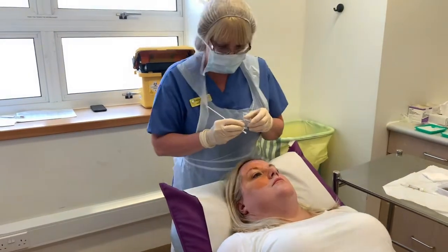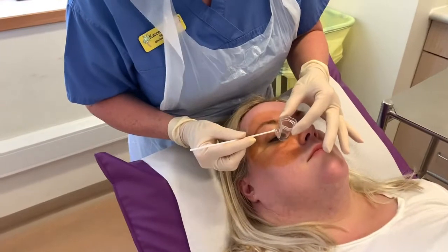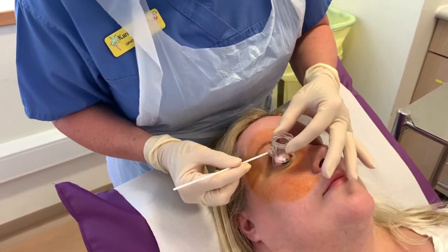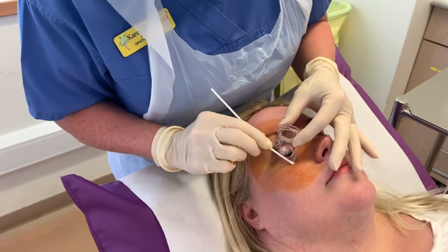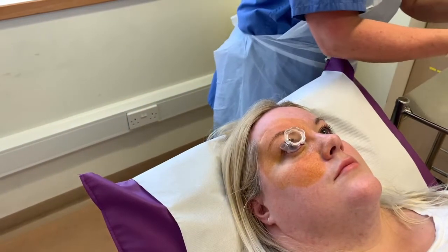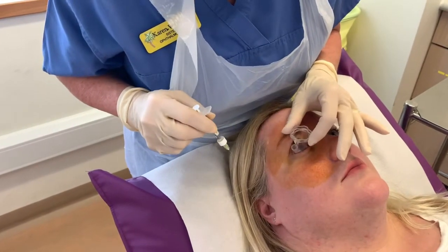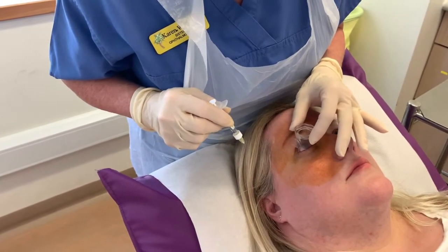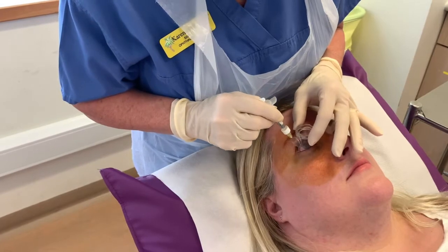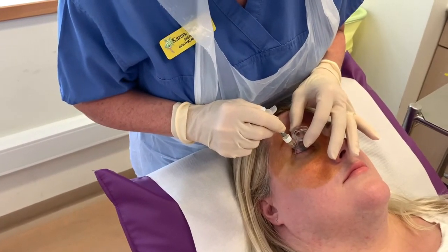So just going to pop this little instrument in. So what I need you to do is look down to your toes as far as you can go. Keep looking down, now look at me. Lovely, just hold your eye nice and steady for me. Okay, so keep those shoulders nice and floppy. Keep looking where you're looking and keep that breathing going in and out for me. So in and out.